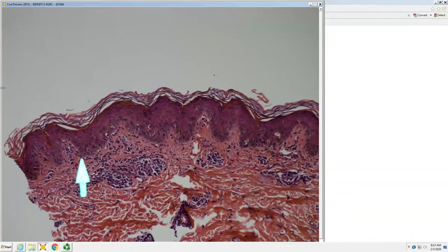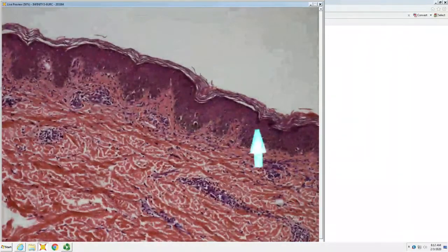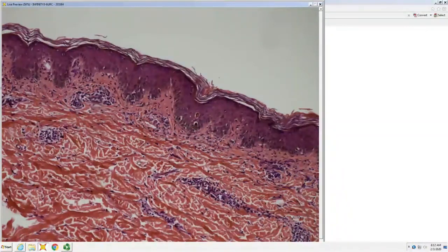So what kind of subacute process would give you lots of interface dermatitis with lots of necrotic keratinocytes? So PR tends to be spongiotic. PLC would be interface. Viral exanthem would be interface. Drug eruption would be interface. Graft versus host would be interface. This particular example is graft versus host disease. I don't really see the clue of a lot of background atypia and disorder of the epidermis in this example. But acute drug eruption, syphilis, graft versus host would all be in the differential. Viral exanthem would be in the differential.